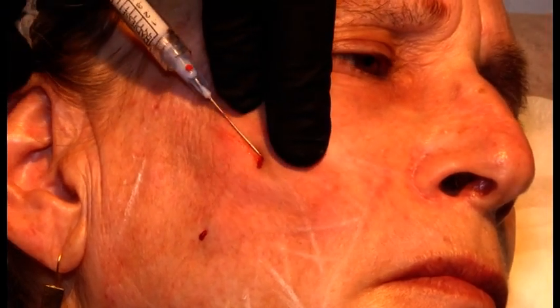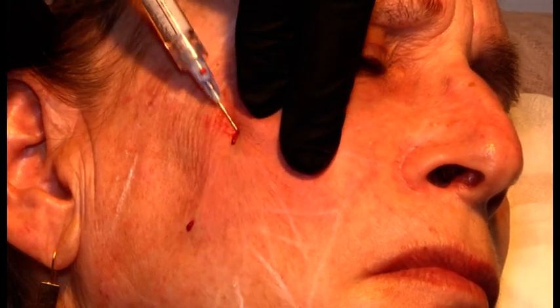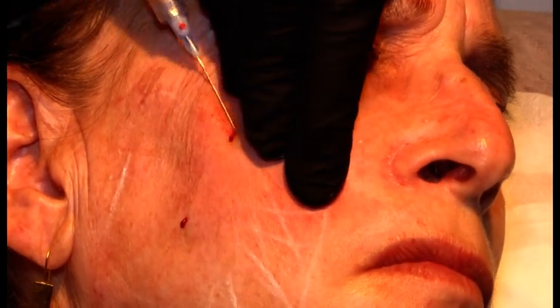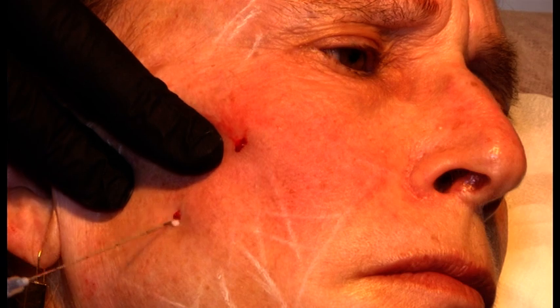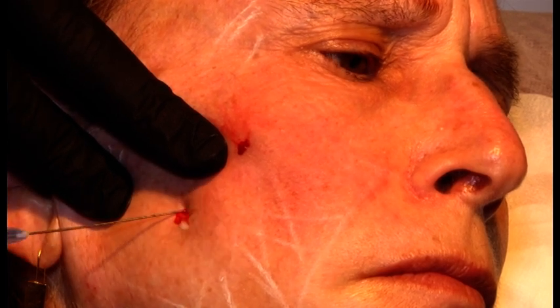And now it's not compressible, which is much more convenient. She already has some collagen production because of her therapy, so it's a bit more difficult to get past some of the collagen resistances.